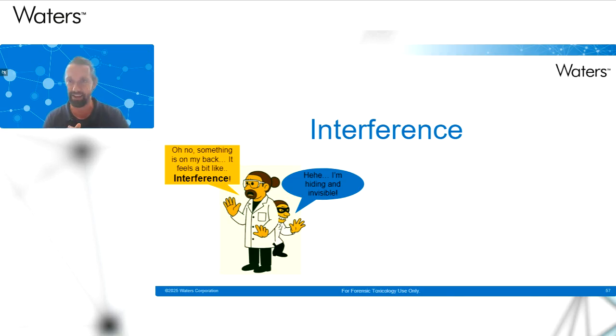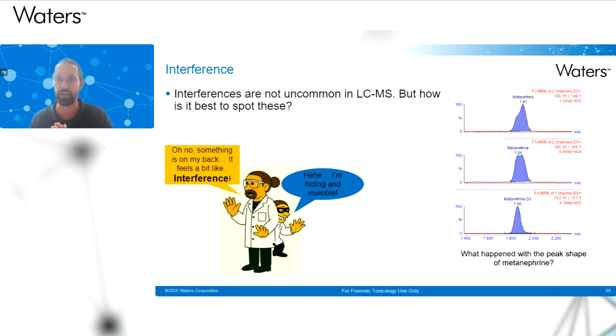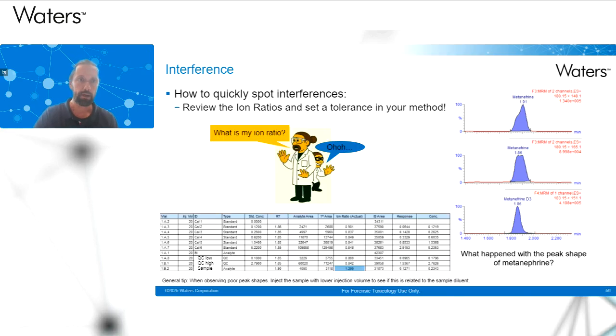That is a very typical issue that we can encounter with LCMS analysis. And this is the chromatogram that I showed you in the very beginning of the presentation. So in this case, metanephrine is showing a broader peak than what we would be expecting. But what can we do in our method to spot these interferences? Because we do not want to integrate too large of a peak area and overestimate our reported results.